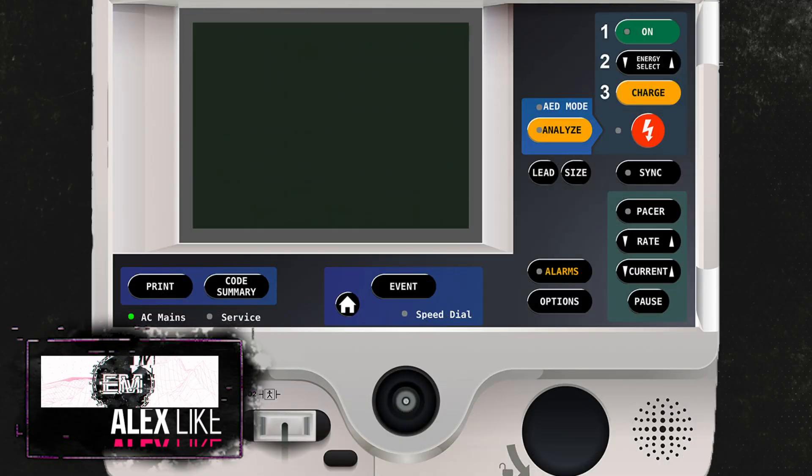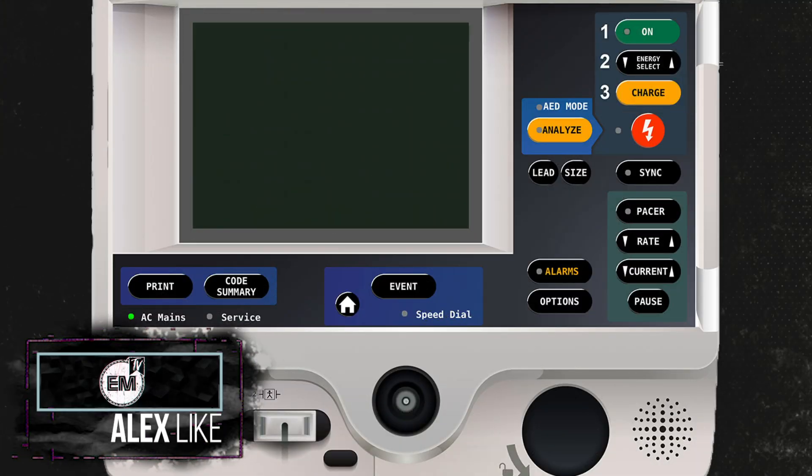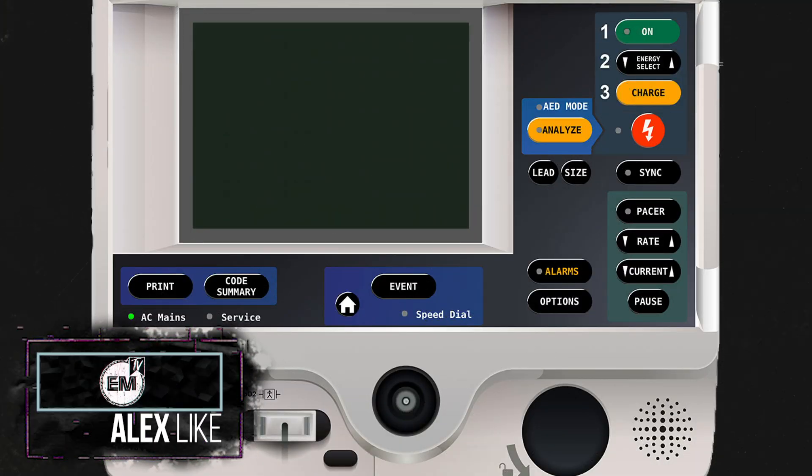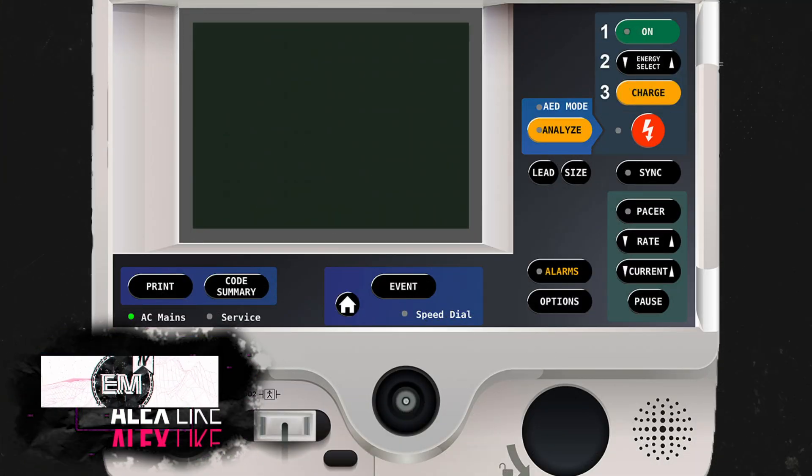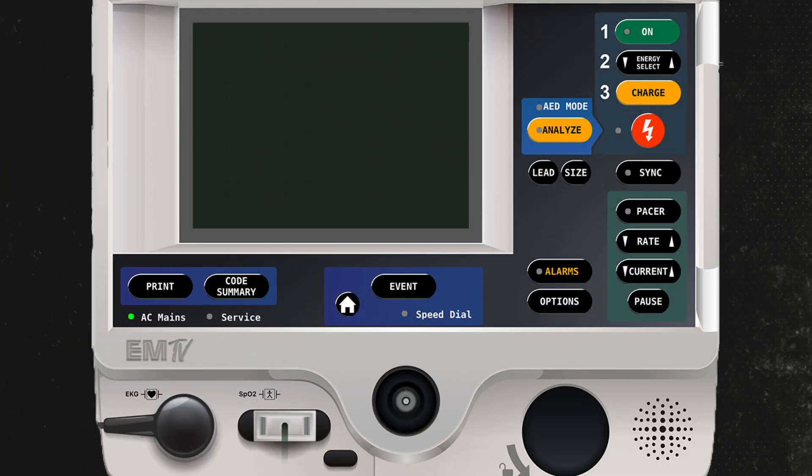Hey everyone, in today's video I'm going to show you how to use the synchronized cardioversion function on a LifePak 20.